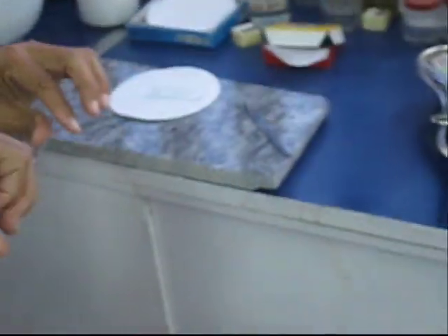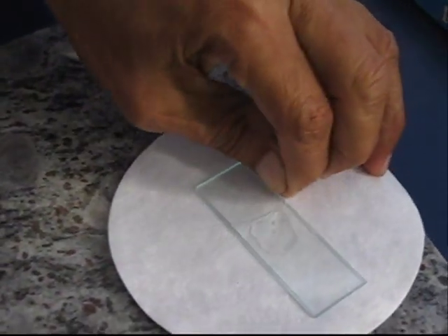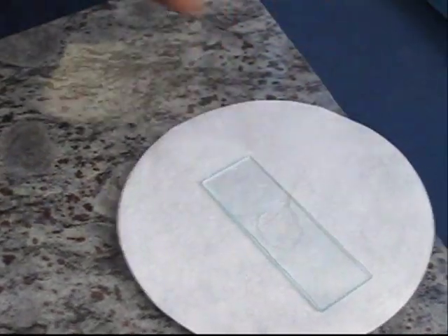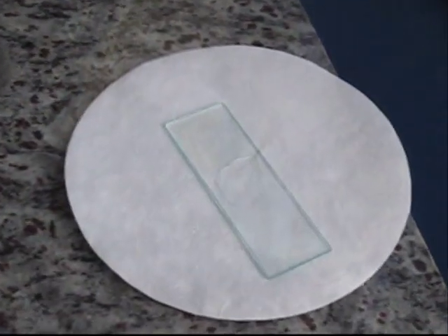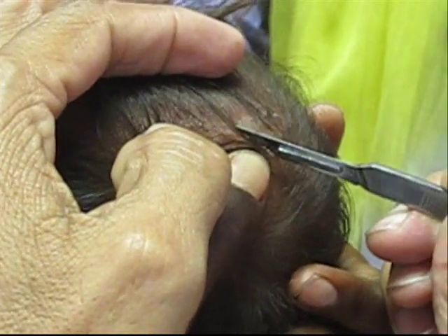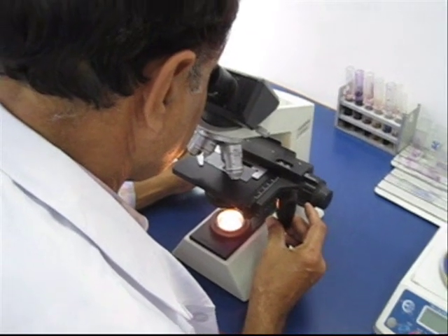Since KOH does not dissolve the fungus, we will see it under the microscope. For hair samples, pluck the hairs, cut the extra part, place the roots on the slide, put the cover slip, and examine it under the microscope.